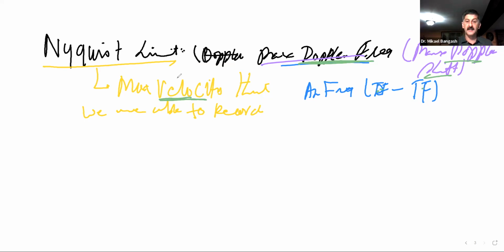But we translate that Doppler shift frequency into velocity of blood. Clear? Did that make sense? So the maximum velocity, the highest velocity that you are able to record, that is going to be considered as your Nyquist limit.